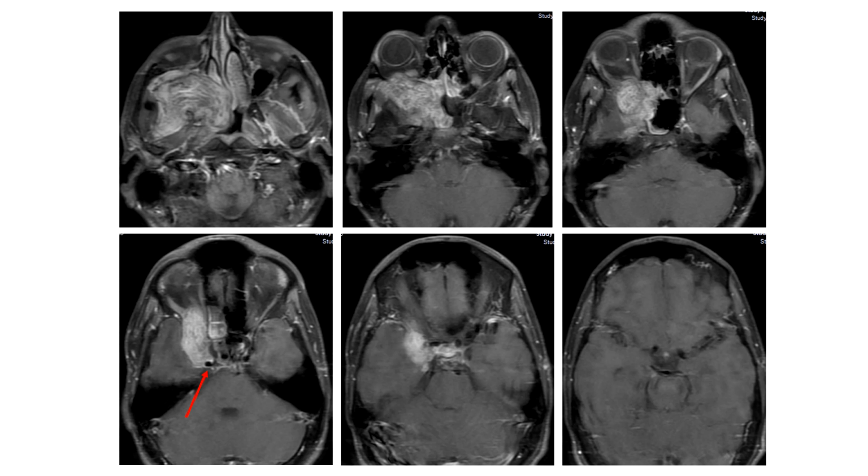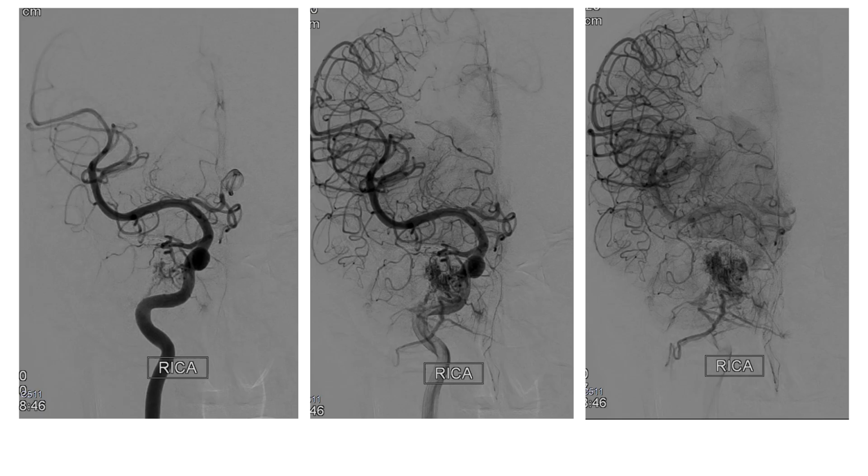about between 180 to 270 degrees. I would say it's not completely encircling, but the neurosurgery and ENT team were a bit reluctant to completely excise this tumor. So they asked for a preoperative DSA and embolization of this case. This is the right internal carotid artery injection. This is the frontal view.